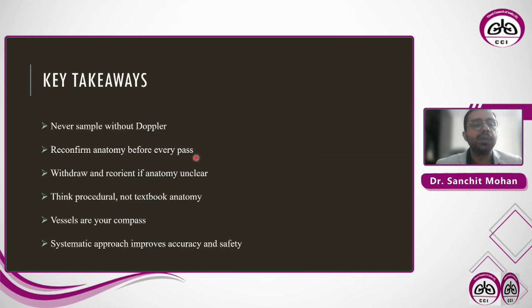So the key takeaways from my talk: never sample without a Doppler. Doppler is a must and mandatory before each and every puncture. Reconfirm anatomy before every pass. Withdraw and reorient if you are unclear with the anatomy, or if you miss, or if you forget actually where you are. Think procedural, not the textbook anatomy.